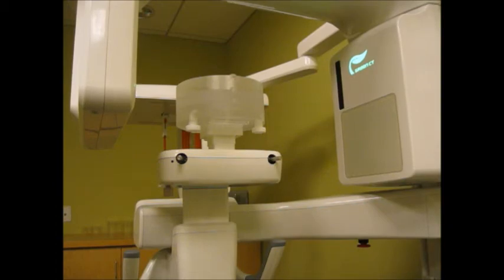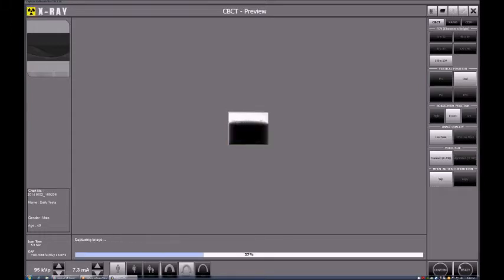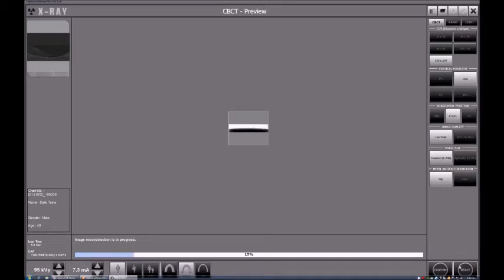This is the first of two CT scans that we need to take daily for inspection. So this is the screen showing the acquisition process, while we were pressing the exposure switch. You can see on the screen that we are taking the image. And after the reconstruction process is completed in the computer, the system will generate the DICOM files.